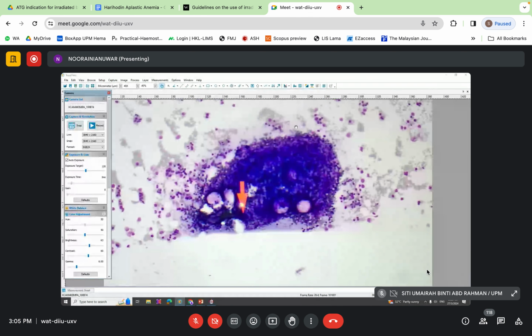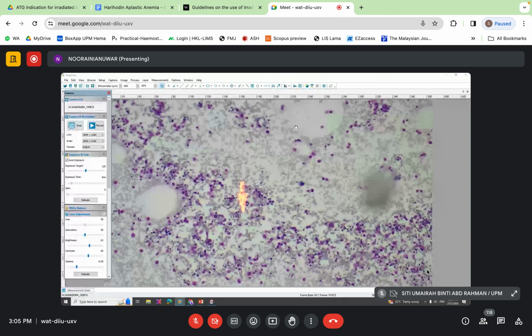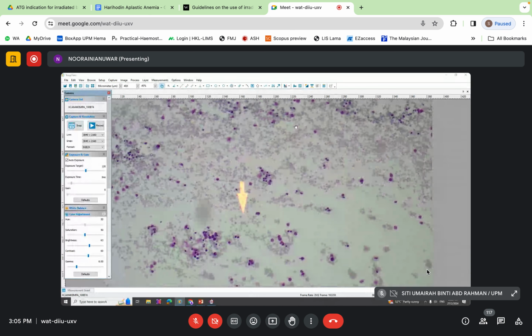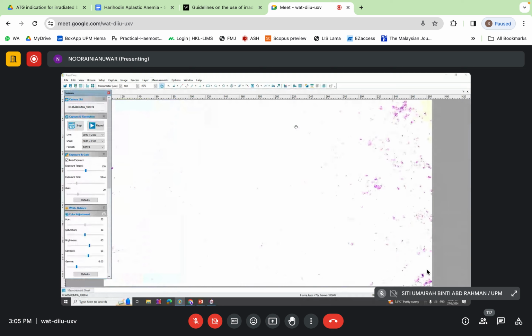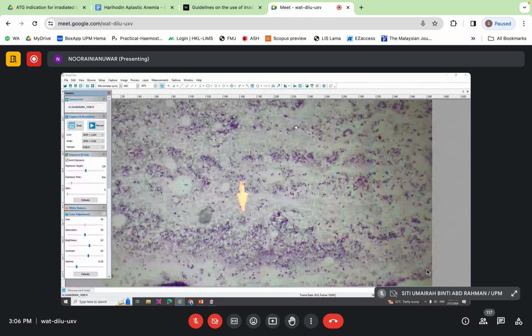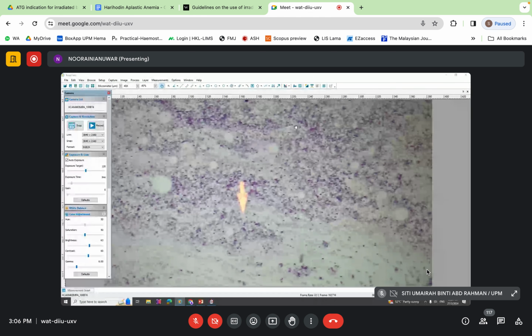In some areas there is an increase in fat spaces, but most of the fragments show hypercellularity with cellular trails. Megakaryocytes are quantitatively adequate, but some of them show hypolobation and widely separated nuclei.